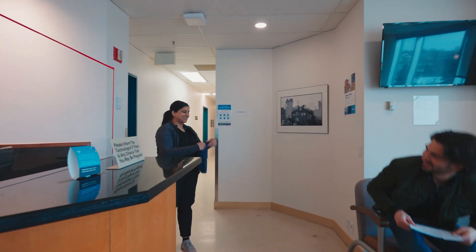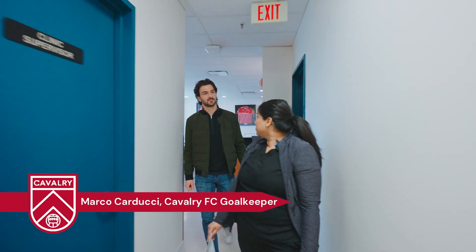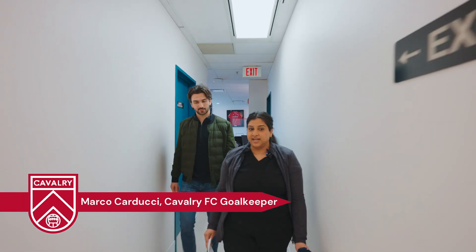Marco? Yeah. Hi. Hello. Come on back with me. There you go. So Marco, I'm Shyla and I'll be doing your ultrasound today.